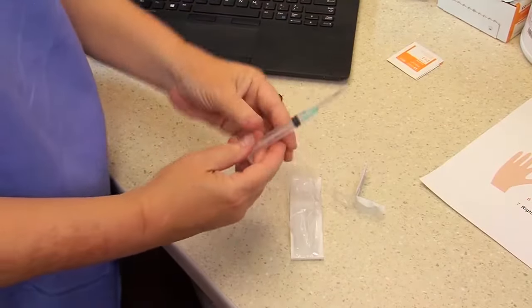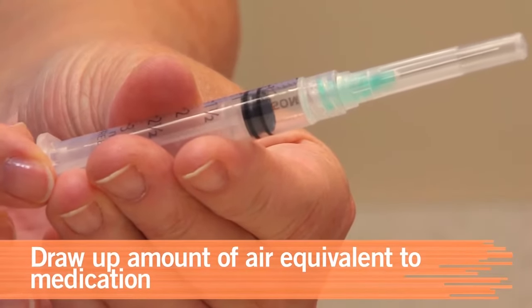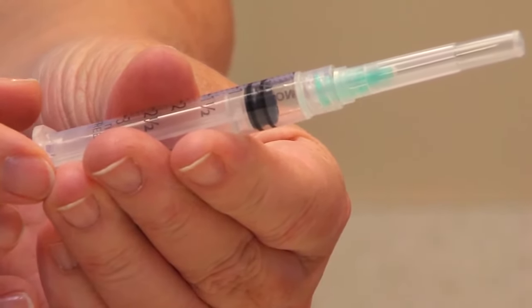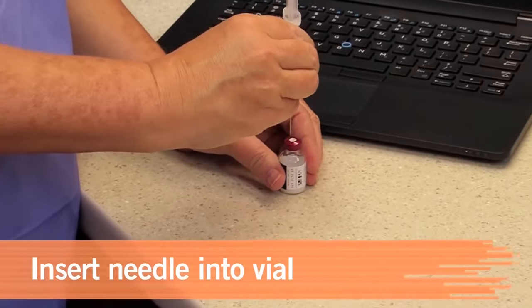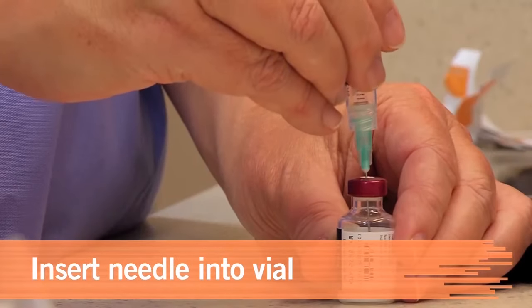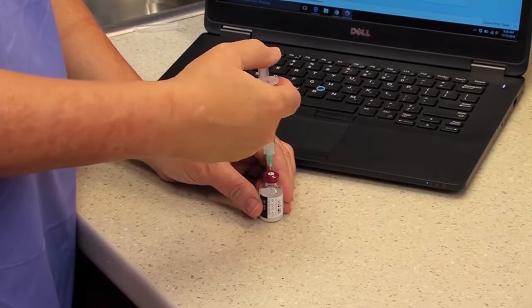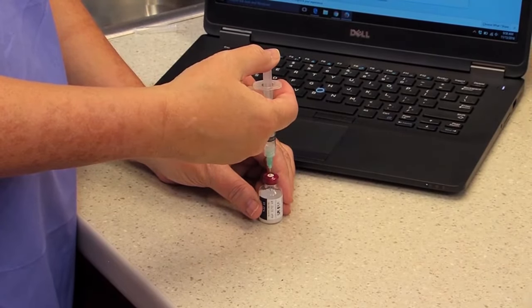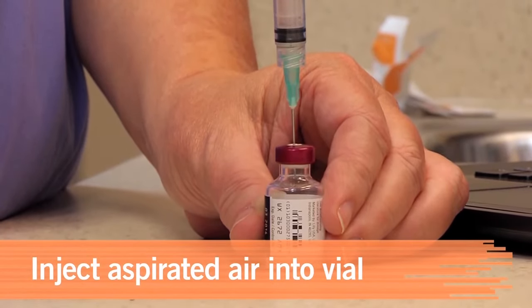With the needle cover in place, grasp the syringe plunger and draw up an amount of air equal to the amount of medication ordered. Uncover the needle. While holding the vial in place, carefully insert the needle into the center of the rubber stopper. Make sure the uncovered needle touches only the clean rubber stopper. Now, inject the air in your syringe into the medication vial.